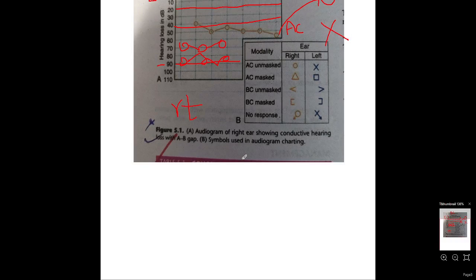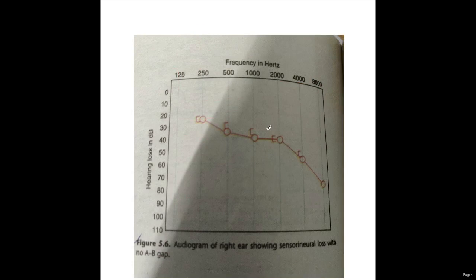Okay, let's look at this picture. Basically we'll first see the signs, this and this. So I have told you before, this is the sign for the bone conduction of the right ear. O is the sign for the air conduction of the right ear.